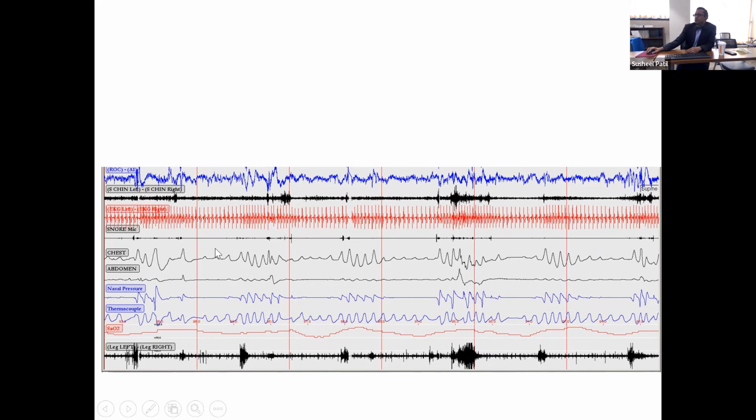Is there a certain amount of, because I've seen a couple of sleep studies where I'm looking at it, I'm like, I can't tell if there's effort or whether or not there's not effort, because there's something going on, but it's not like the textbook ones where in the obstructive, obviously it increases.